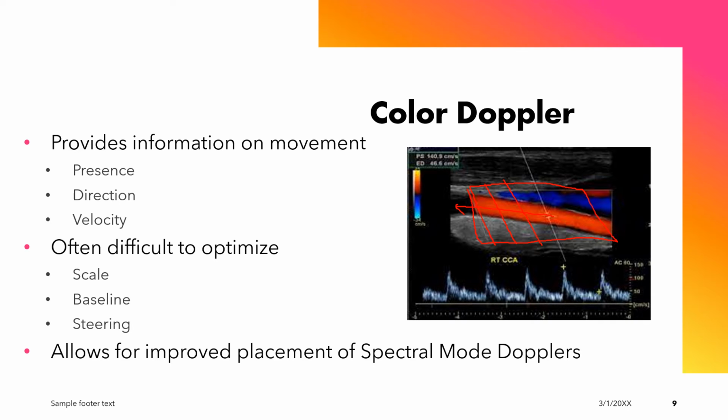That would be the maximum scale of velocity that the color could demonstrate. So if I saw something in this bright orange hue, I could say, oh, that must be going nearly 60 centimeters per second. If it was lighter and lower and closer to the baseline, I would know that it was less than 60 centimeters per second. This can be very helpful when you're coming into a stenosis and you see elevations begin to rise. It can show you where the fastest parts of the flow are for when you go on to take your spectral Doppler, as we'll talk about shortly.